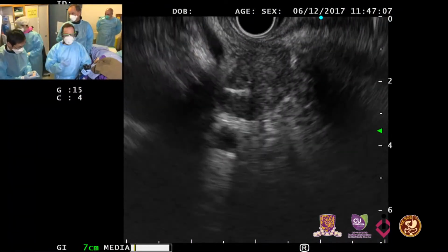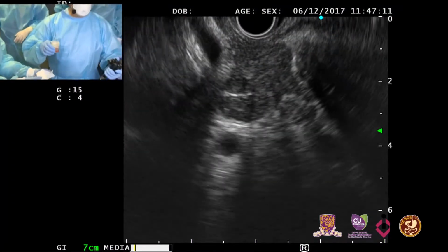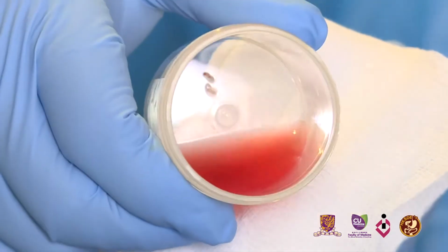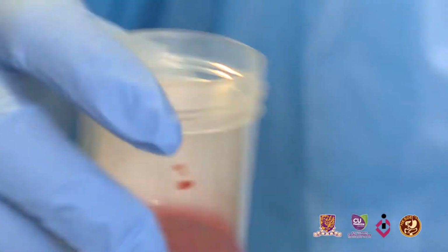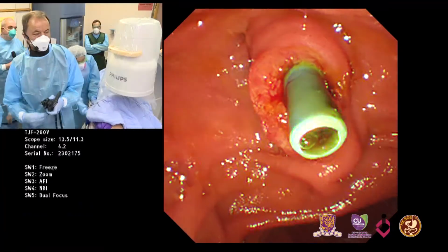Okay, Irving, it was a very good presentation. I don't know if you can point to this to see the sample. Why don't you close it? Okay, we saw the sample. I think we can switch to the other room.